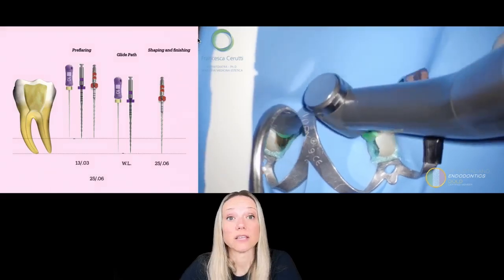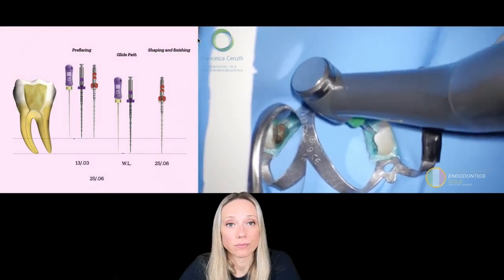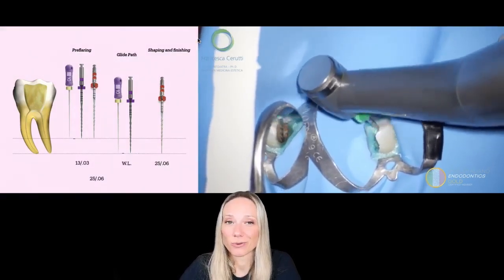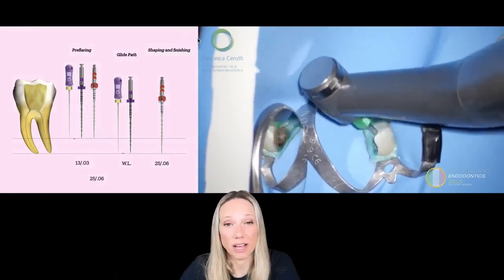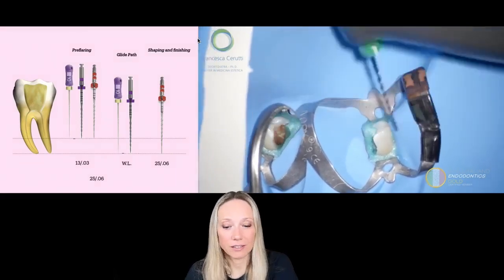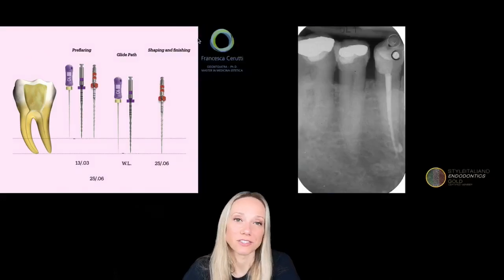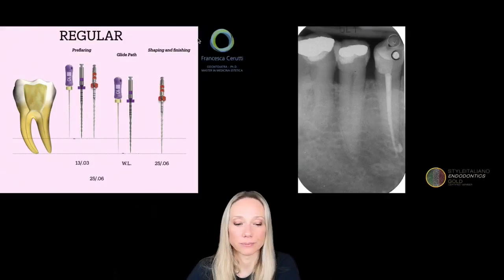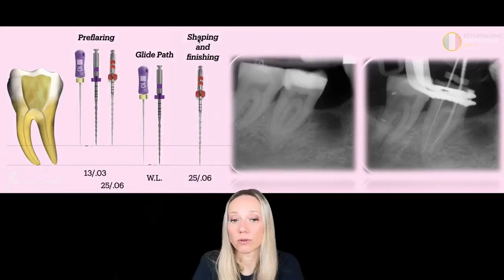In this case, the apex was larger. I took the 35. It's the tooth that decides which is the last file that you're going to use, unfortunately, because you have to adapt to the anatomy. So you have to be flexible in your mind and just understand which is the size that you have to use in your files. And then I do the filling. And this was the regular. That was a monoradicular tooth.